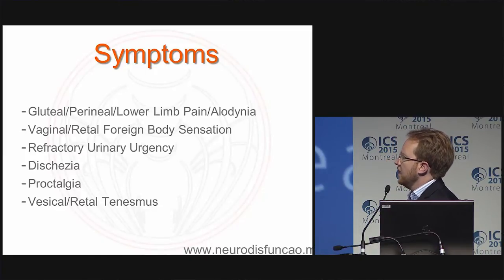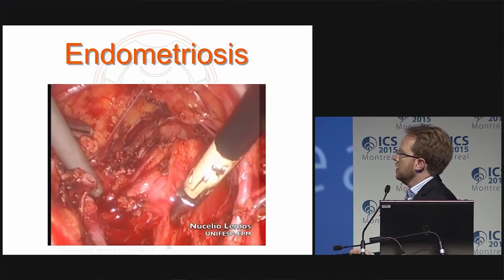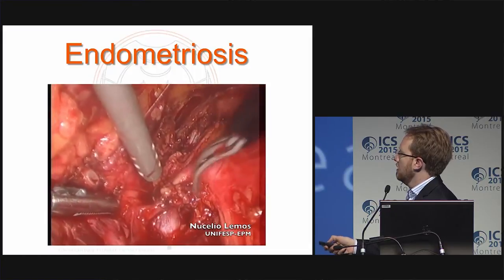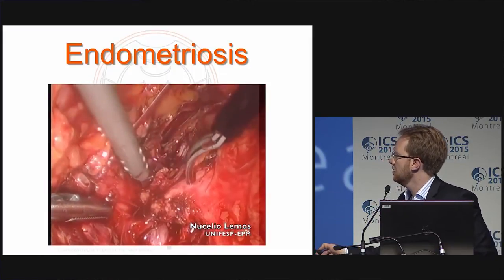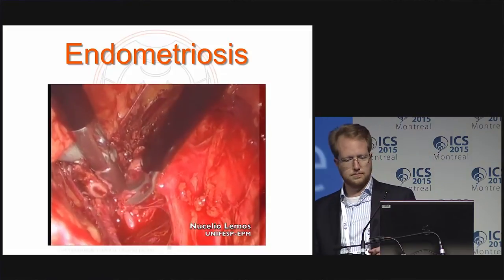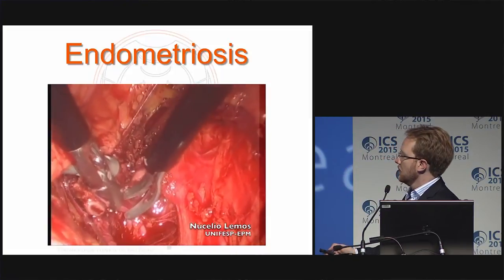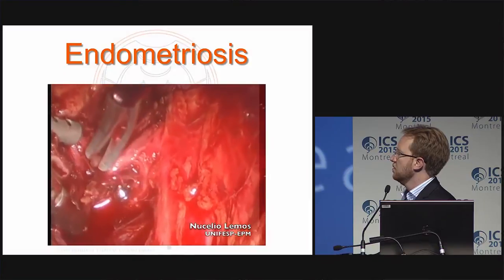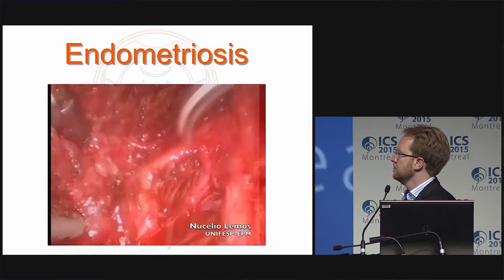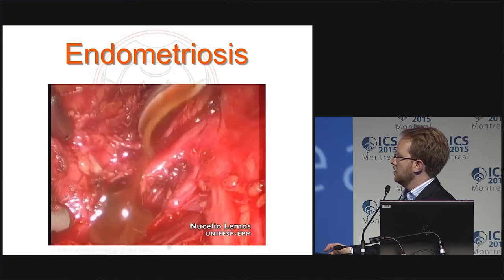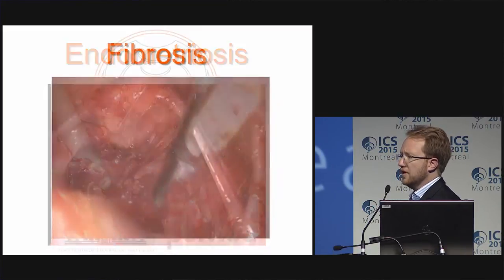Additional symptoms include proctalgia, vesical tenesmus, and vaginal foreign body sensation. Here are examples: this is the sciatic nerve, S3 incarcerated and trapped in endometriosis. This is S4. We're dissecting S2 out of the endometriosis, and you can see that the nerve root here is dilated — the cause being endometriotic infiltration on the nerve roots.